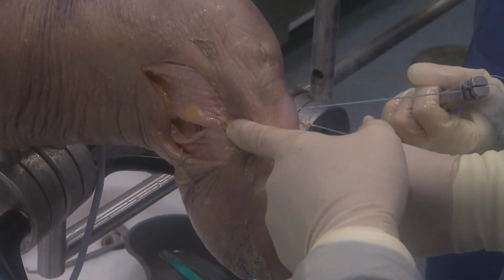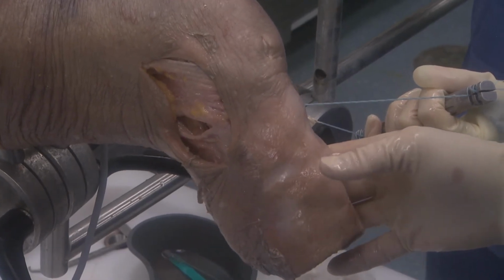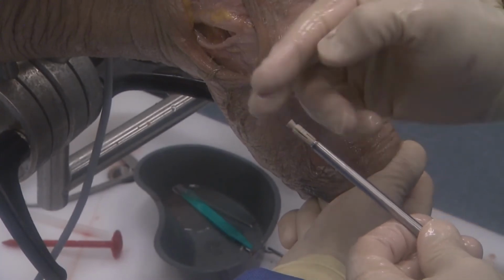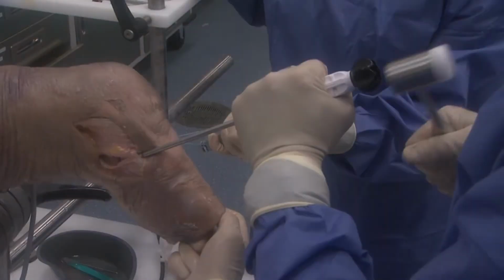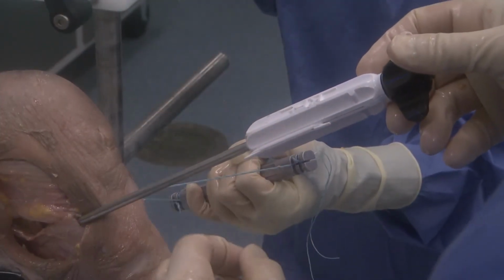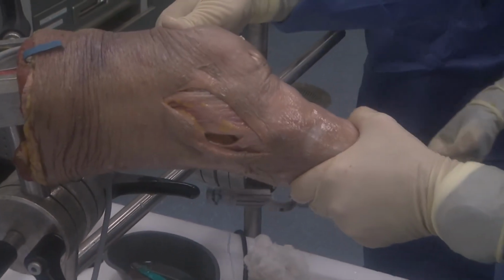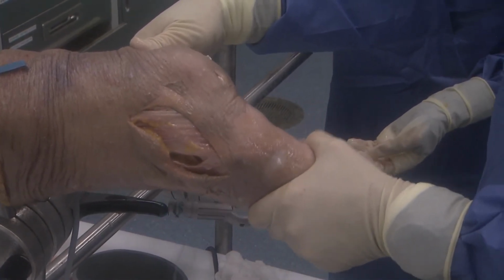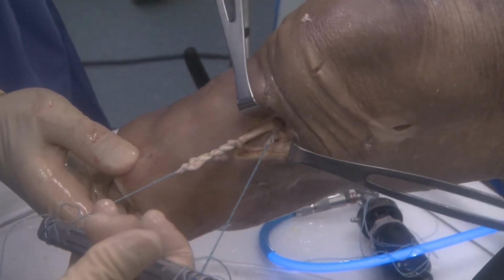During the fixation of the lateral collateral ligament, which is what I'm going to fix by fixing the fibula, I place the knee in slight valgus. This device usually comes with a loop, but we've cut the loop off, and then we insert this into the tunnel. We insert right down to the laser line, and we turn until we hear an audible click like that. So now we've recreated the lateral collateral ligament, and the patient is now stable in varus at 30 degrees of flexion. Now we're going to recreate the fixation on the tibia.